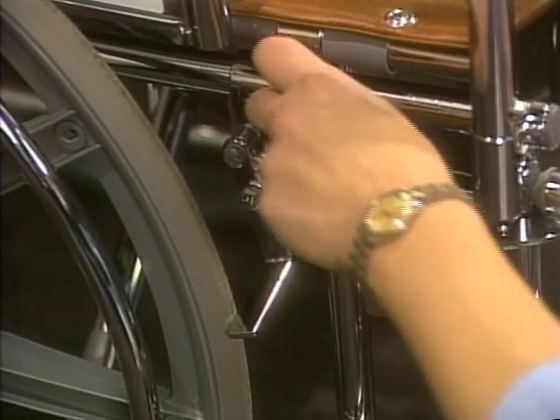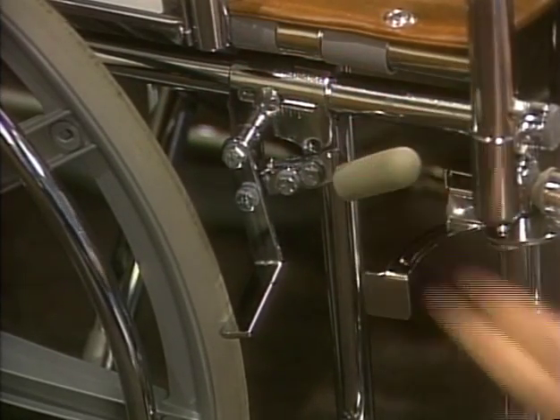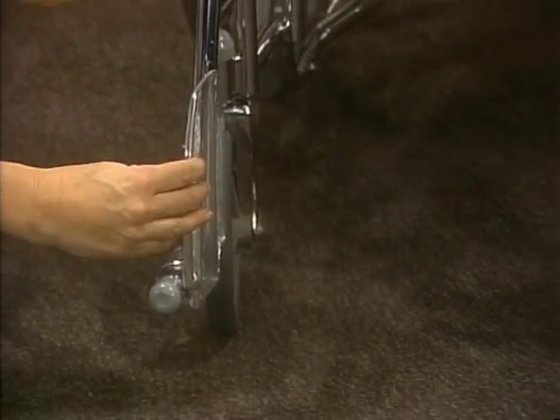Lock the brakes and remove or fold the footrest so the patient will not be injured. When the patient is lying in bed, there are two distinct parts to the procedure of transferring him into the wheelchair. First, help him to sit up, and then help him to transfer to the wheelchair. There are several ways to get the patient into a sitting position, depending on his abilities and level of participation.